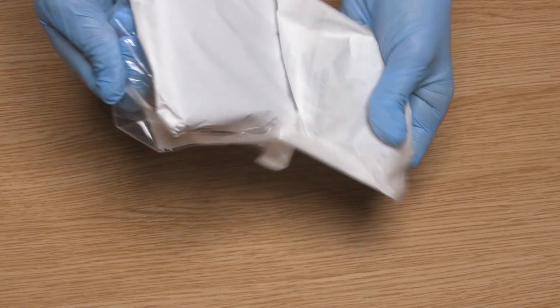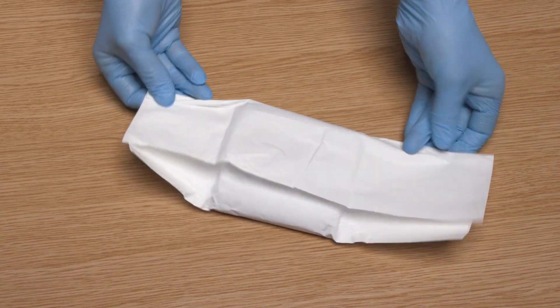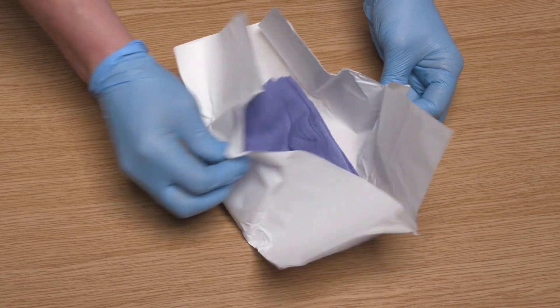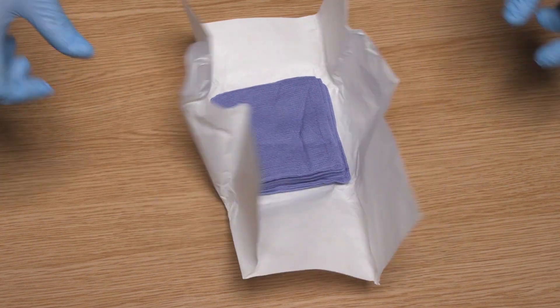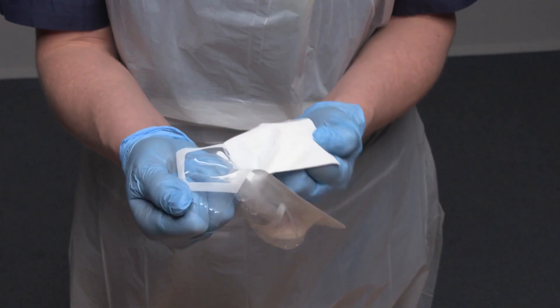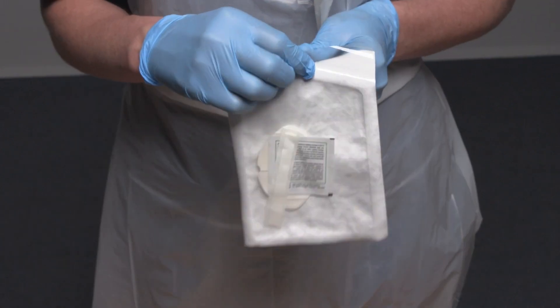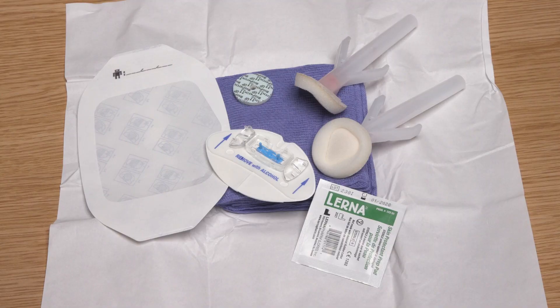Open the packet of sterile swabs, discard the outer packaging, and open the inner packaging that is wrapped around the swabs using an aseptic non-touch technique. I am being careful to only touch the outside of this packaging and not contaminate the inner side, as this is a sterile environment. I am now going to open the remaining equipment that I need using an aseptic non-touch technique, carefully peeling open the packaging of each item and dropping it gently onto the critical aseptic field.